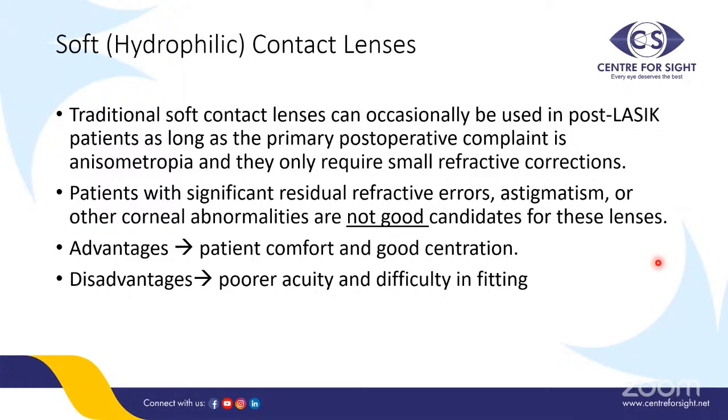Coming to soft hydrophilic contact lenses, these are traditional soft lenses that may be worn post LASIK as long as the primary postoperative complaint is anisometropia and they only require small refractive corrections. However, it is important to note that patients with significant refractive errors are not a good candidate for the soft lenses.